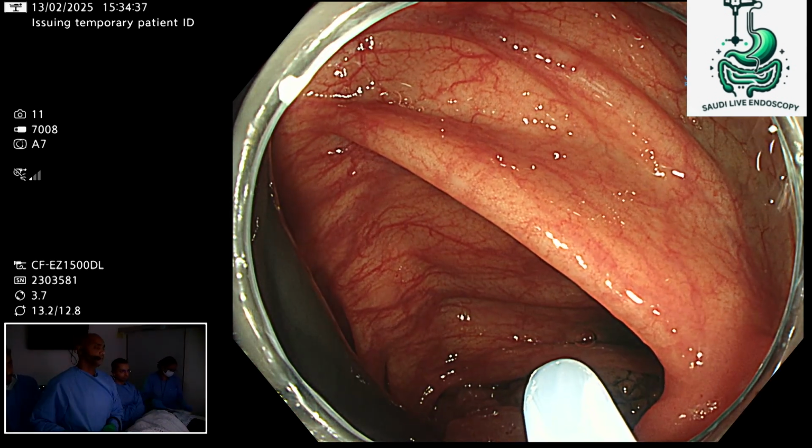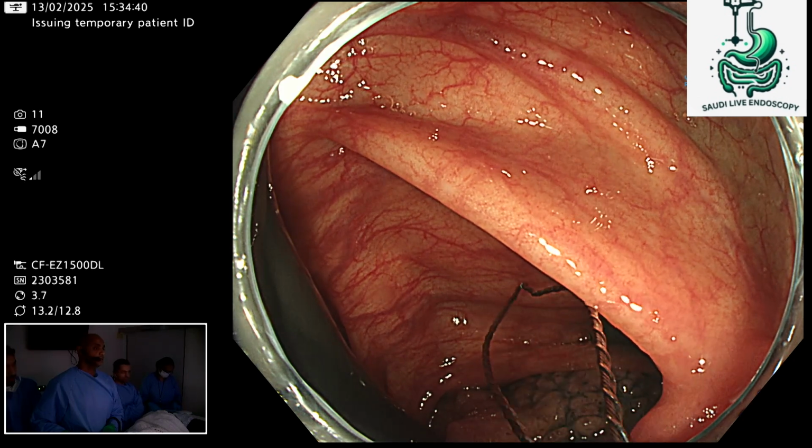Open completely, yeah. Completely open. Keep it open for the sit, yeah.